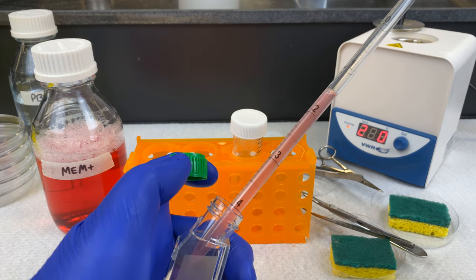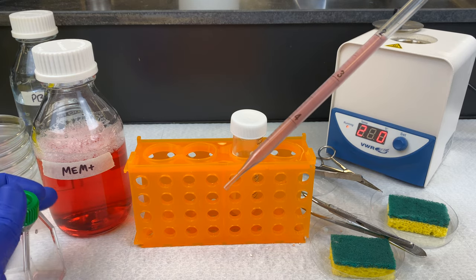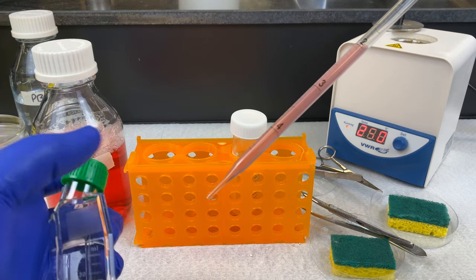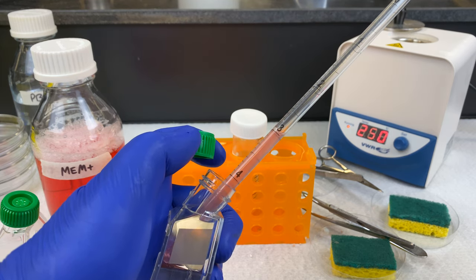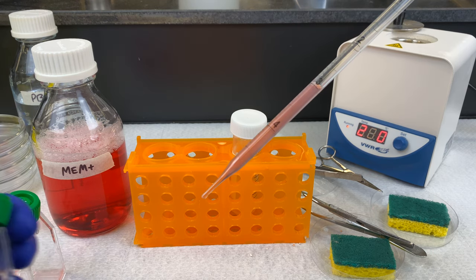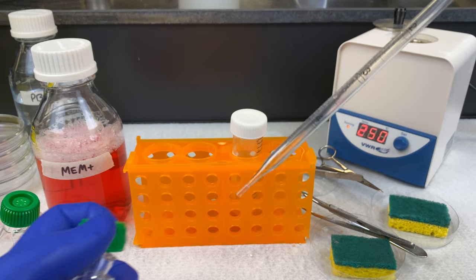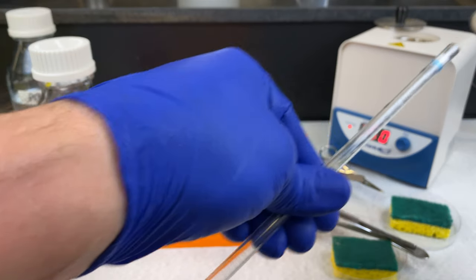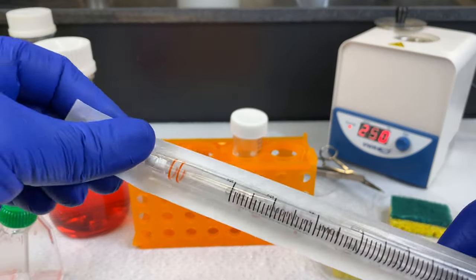I'm not exactly sure what the true concentration should be of cells added into the T25 flasks. As a result, I will seed several flasks, creating a dynamic range. I will add half a mil to one flask, one mil to a second flask, and two mils to a third flask. A T25 flask requires five mils total, so I will use MEM to top up to that.